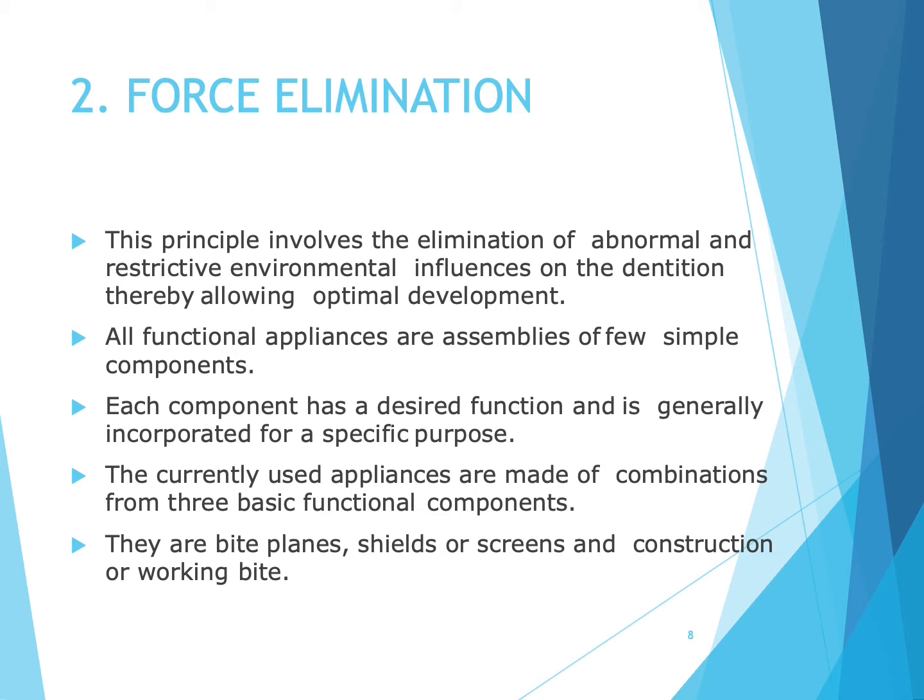The force elimination principle involves the elimination of abnormal or restrictive environmental influences on the dentition, thereby allowing optimal development. All functional appliances are assemblies of a few simple components. Each component has a desired function and is generally incorporated for a specific purpose. The currently used appliances are made of a combination of three basic functional components. So what are these three basic functional components? They are the bite plane, shield or screen, and construction or working bite.